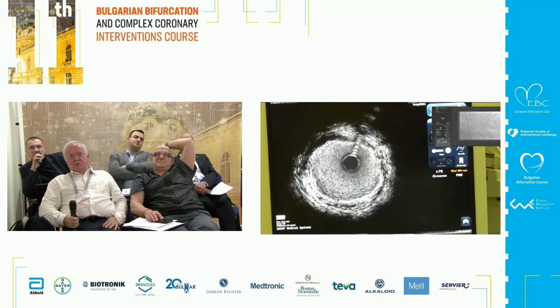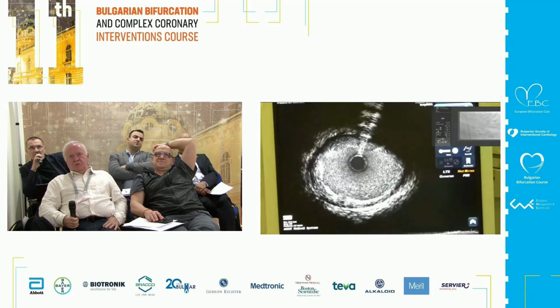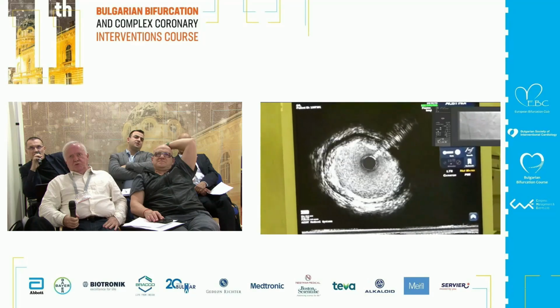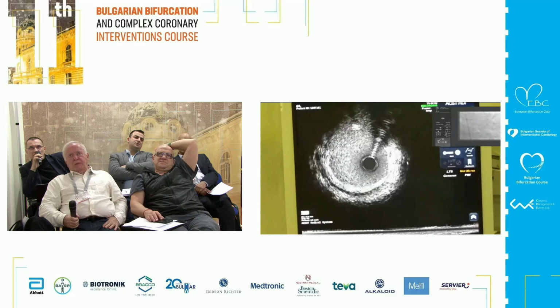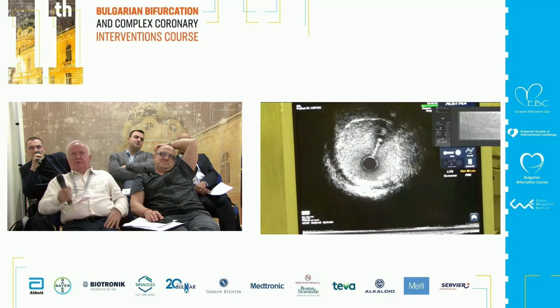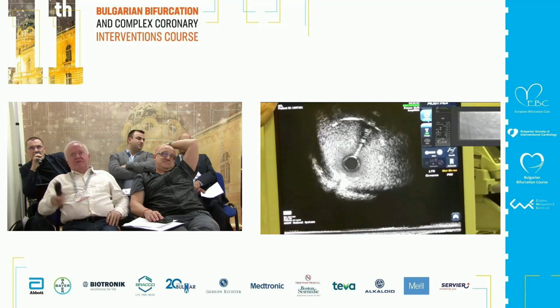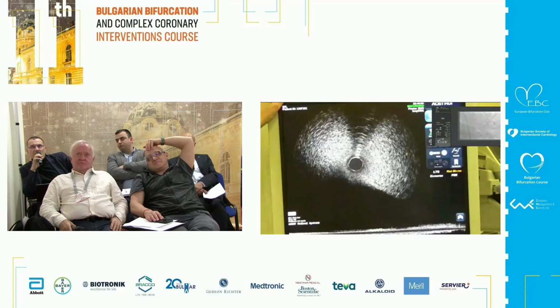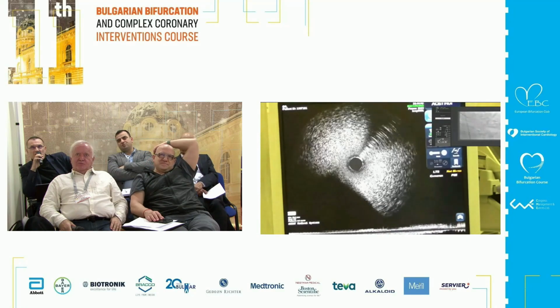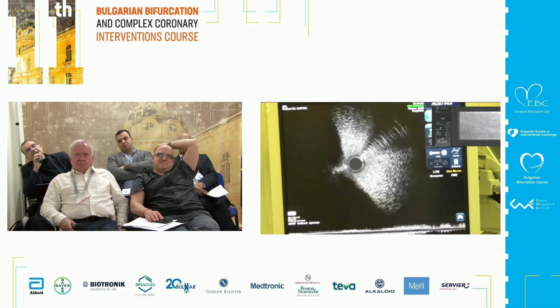Just to see the very ostium, because during the introduction of the catheter, I think that there was one small point with some... Maybe you can go a little, yes, it's around 12 o'clock. There was maybe 2 or 3 struts, but I think that will be, yeah.